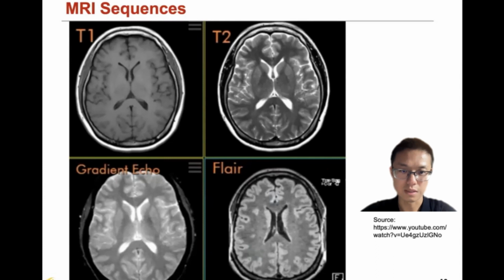Okay, so those are some different MRI sequences, right? So you can see how they are able to capture different contrast or brightness of different tissue parts, so that, maybe using multiple of these sequences, you can make a more accurate or confident diagnosis.